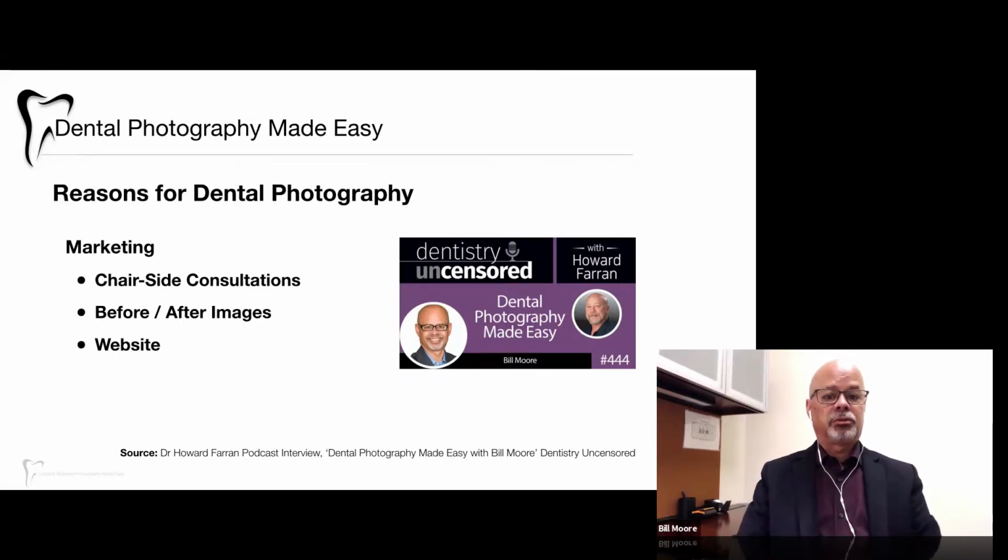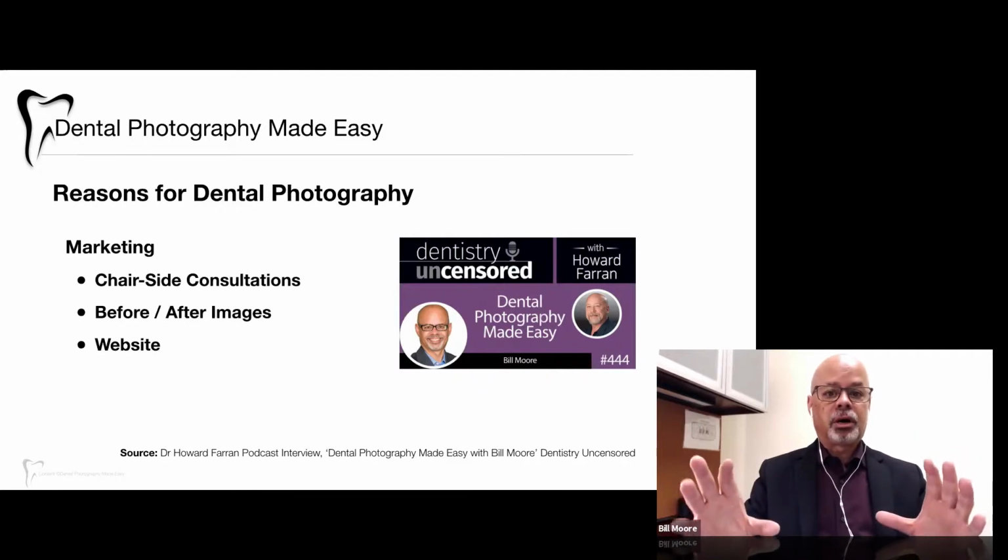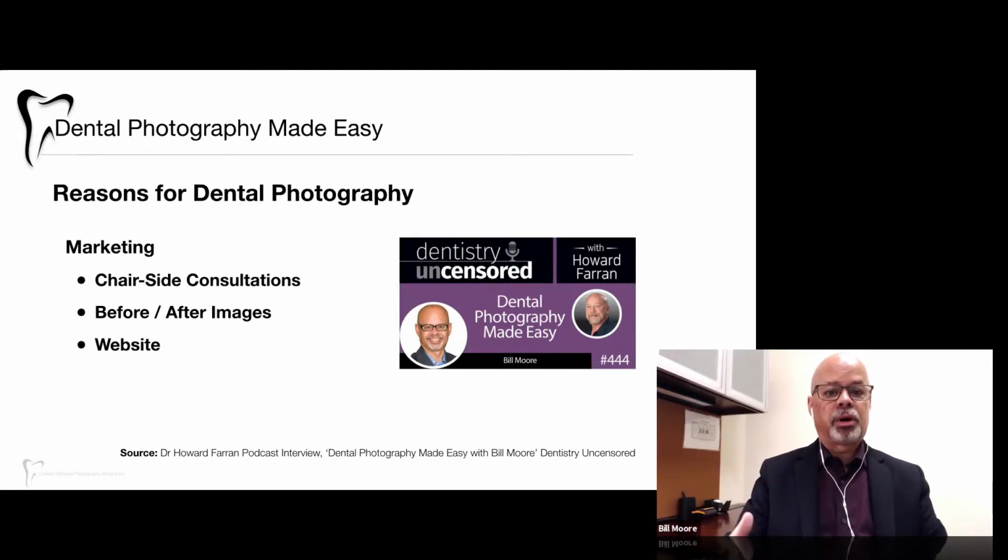You take a series of photographs at the beginning of the time with your patient, you do your exam, and you come back and show the images on the screen. So you find some problems. Instead of just telling them that they have a cracked tooth and they need a build up and a crown and whatnot, you show them on the screen, because they might say, a cracked tooth, well, I don't feel any problems, so why would I spend the money to do that right now?